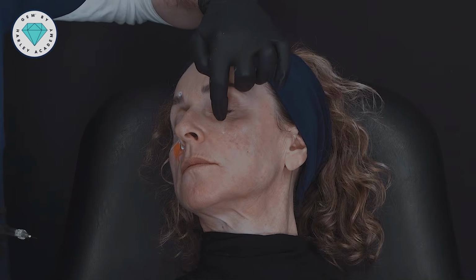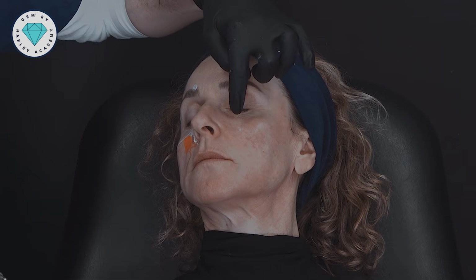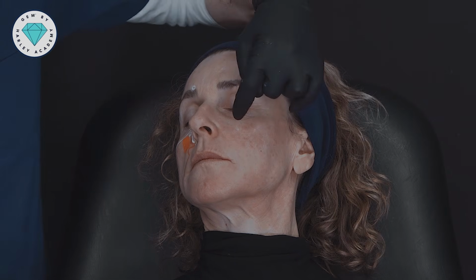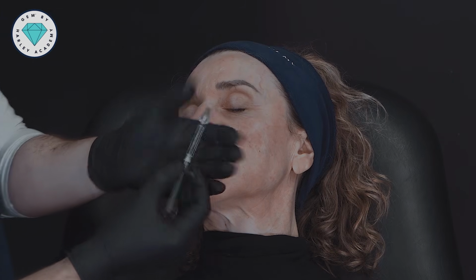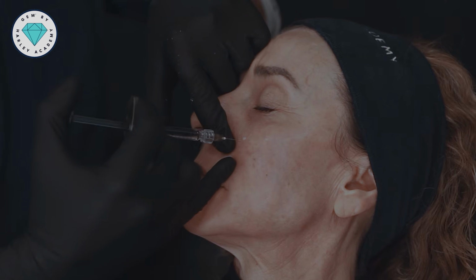Okay, so I found my target, which is just in line with the lateral limbus of the iris and slightly closer to the mid-pupillary line, certainly a safe distance away from the infraorbital foramen. And this is an injection point which is inferior to the zygomatic cutaneous ligaments, and therefore I'm confident this would be volumizing the deep medial cheek fat. I've got my 27 gauge needle and I'm using Reveness Shape. Little injection now down onto bone, nice and still for me.